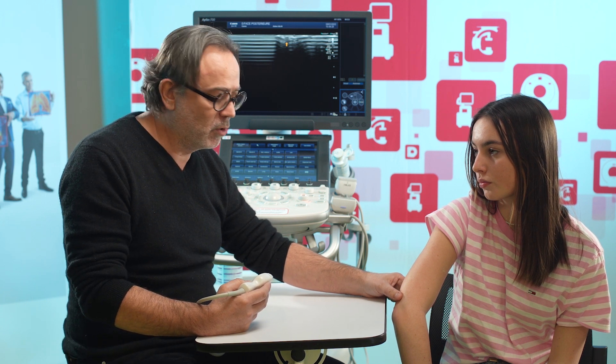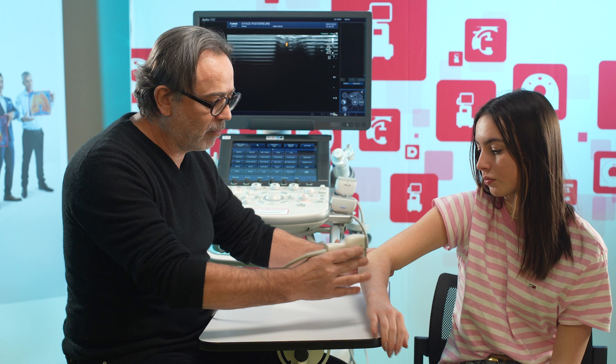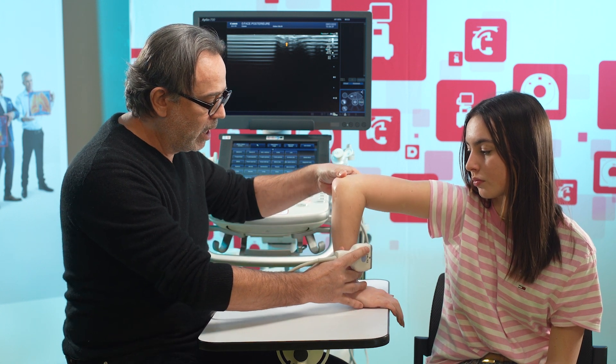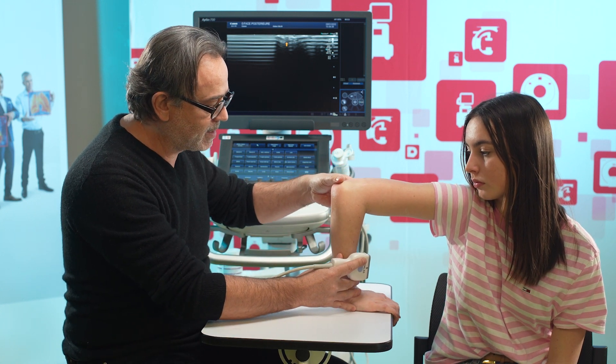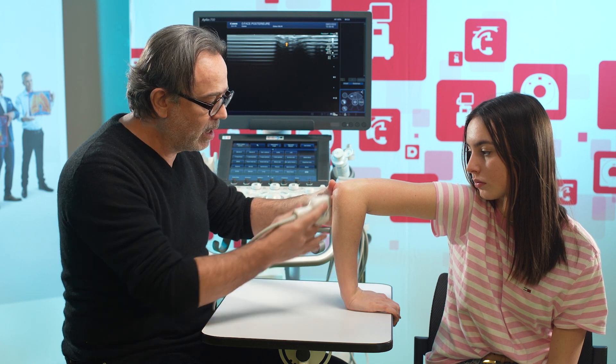We will tackle the posterior compartment of the elbow, which is likely the easiest compartment to examine with ultrasound. Nonetheless, it is still highly relevant because it can be the site of tendon, nerve, articular, or soft tissue lesions. To analyze the posterior aspect, the patient will sit turned three quarters or with their back to the examiner, then place the palm of their hand on the exam table, flexing the elbow this way.